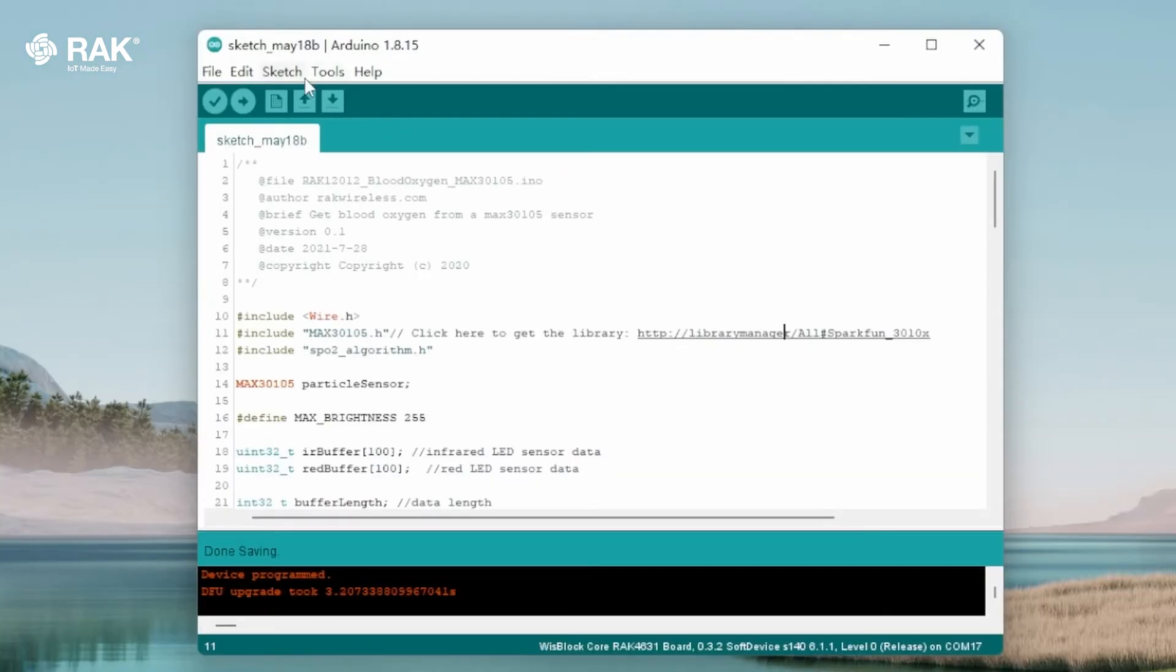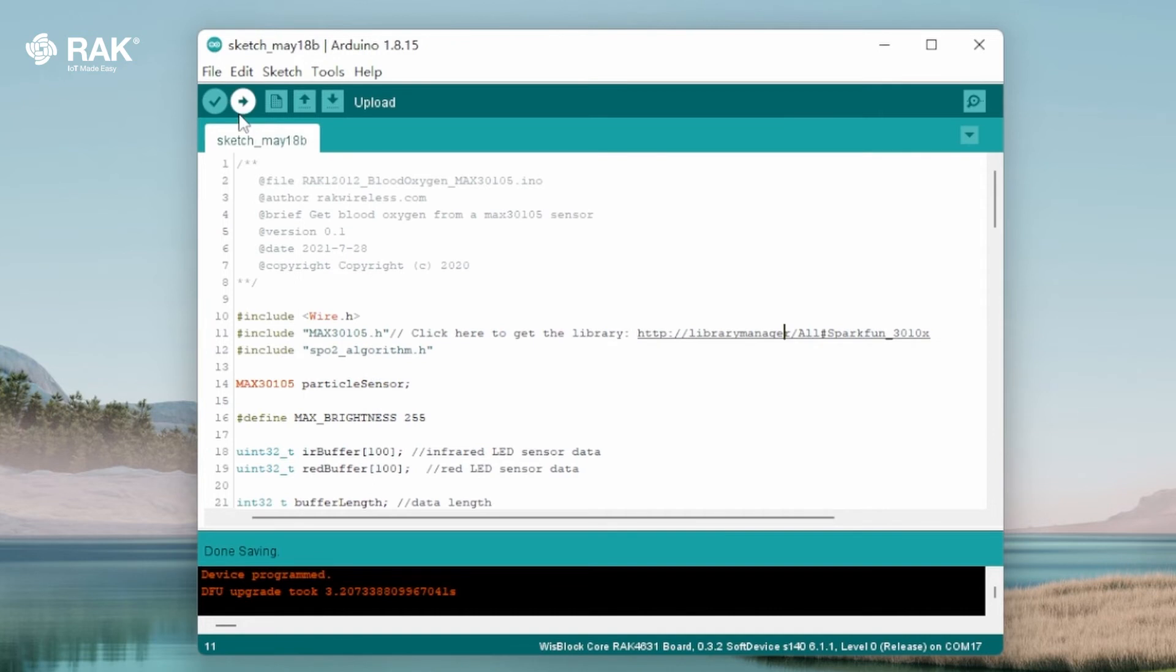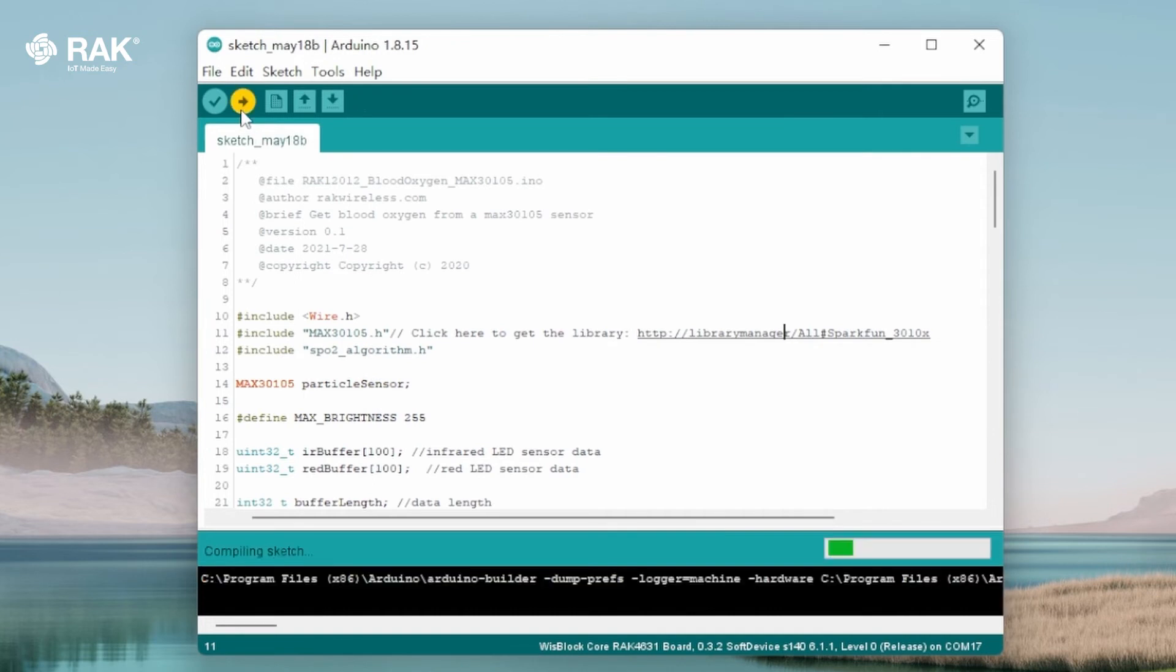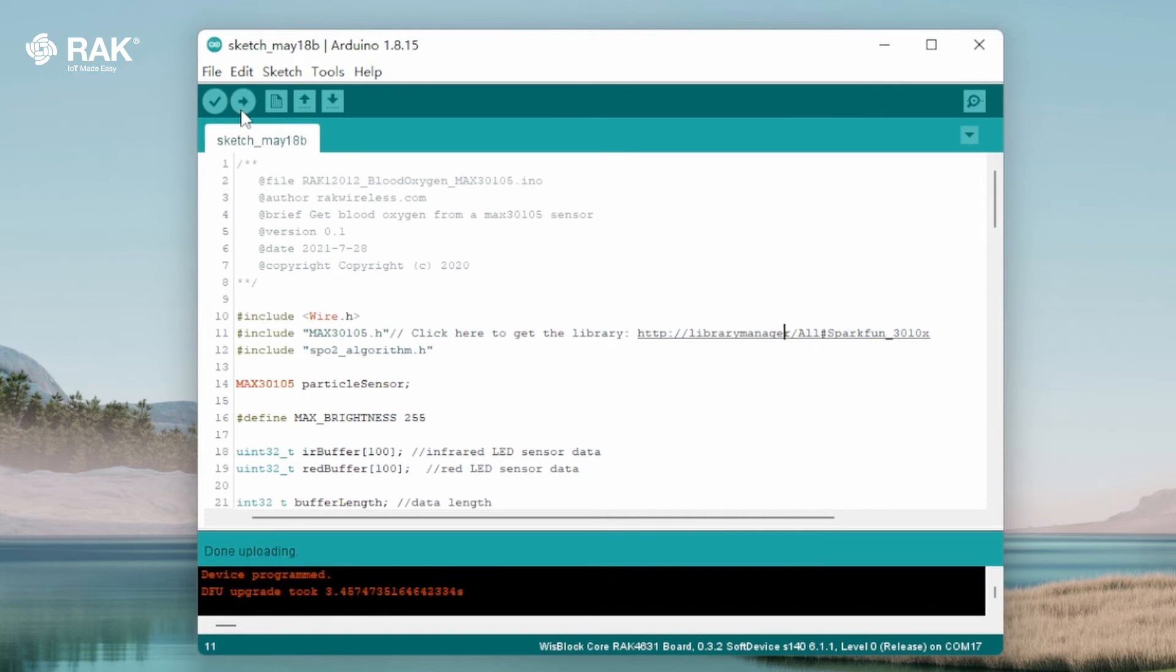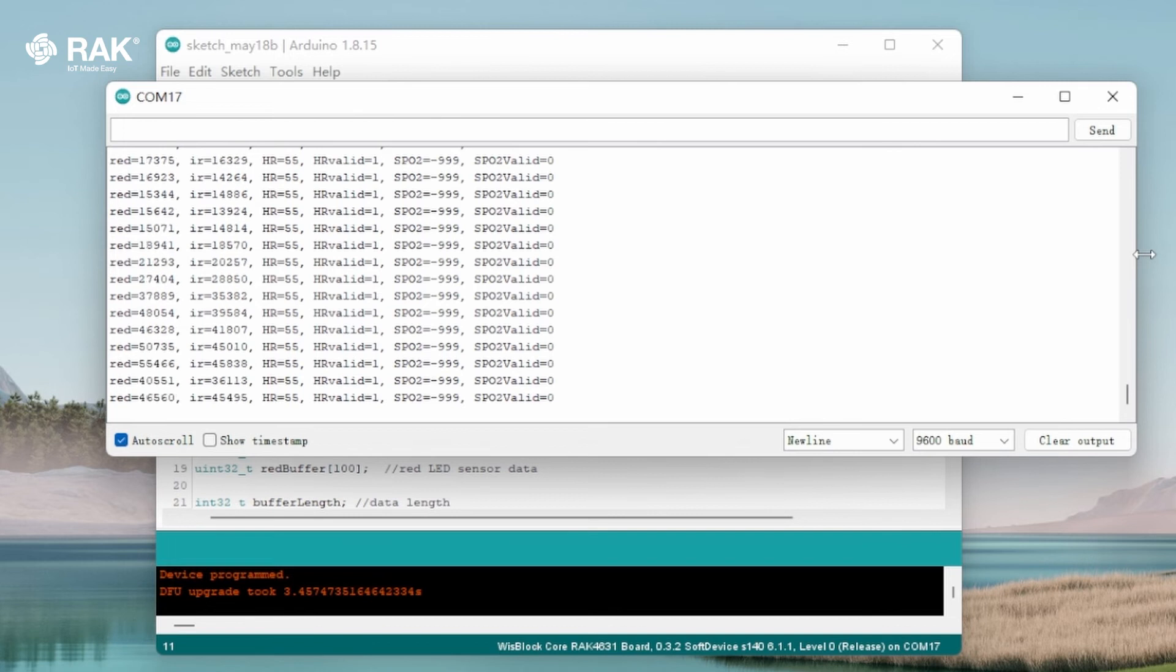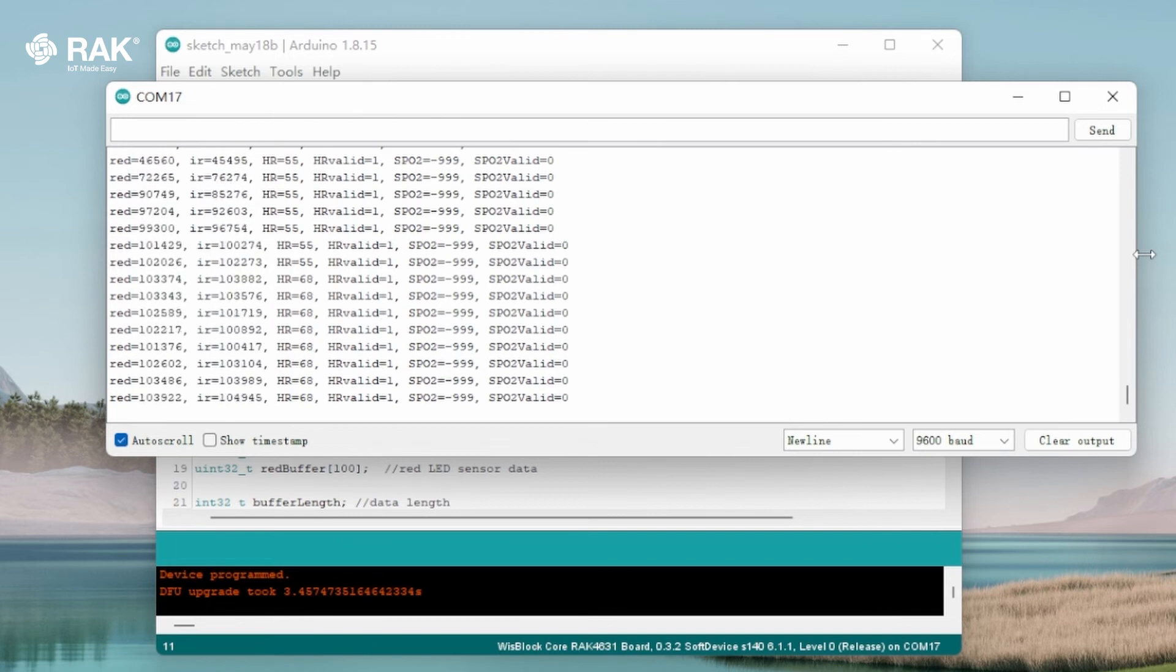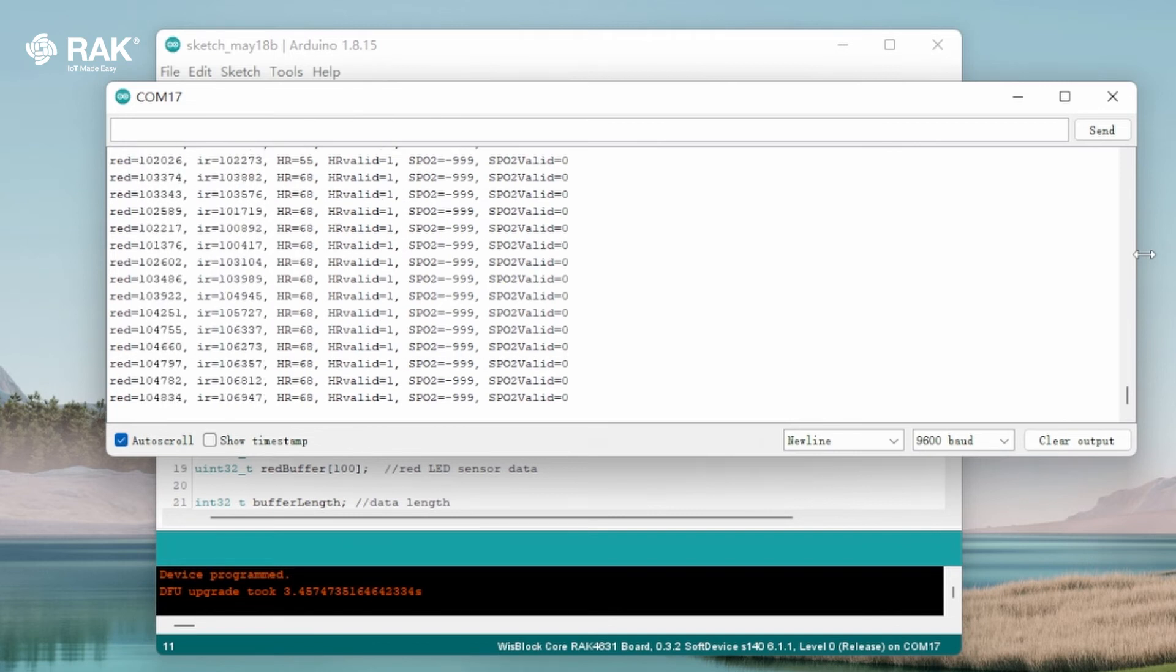Go to tools, port, com17 then upload. Once uploaded open the serial monitor to view logs. RAC 12012 is now communicating with the WisBlock Core.